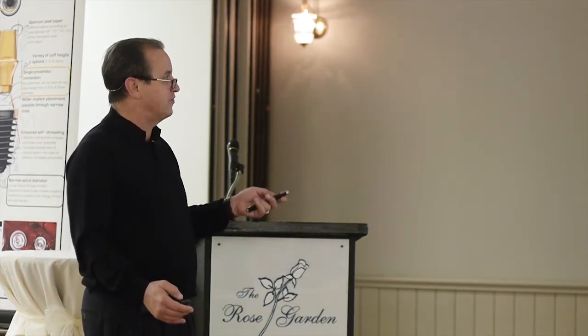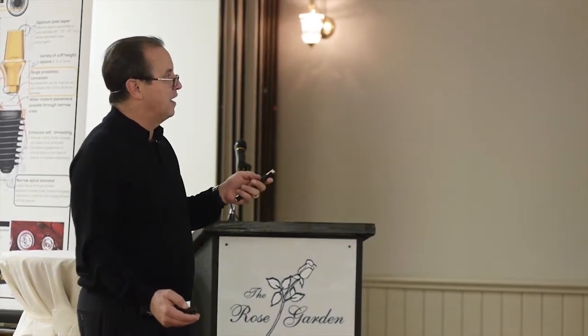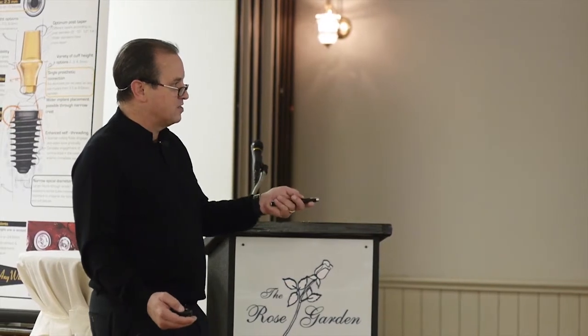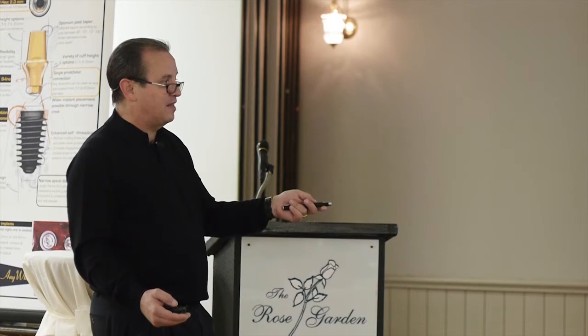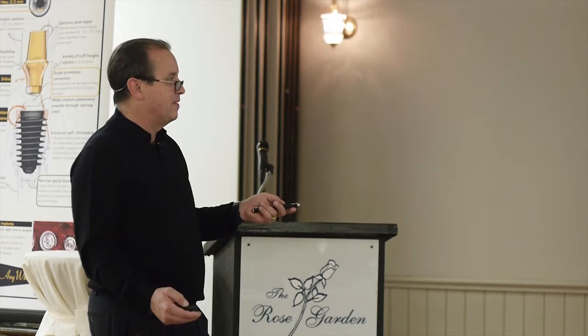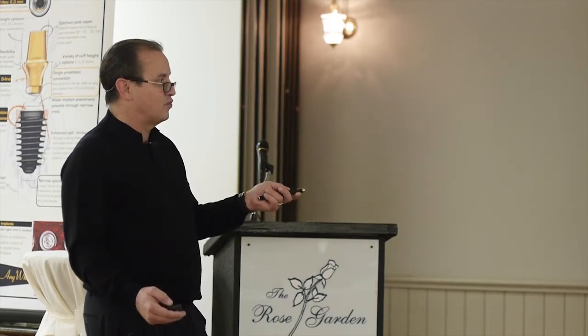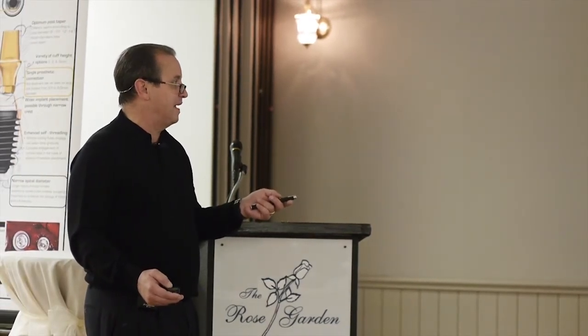You know, we get these great images. I'm going to run through this fast because I know y'all have seen this already. But what I really want you to see is some of the stuff that we're seeing in practice. And this is something that is good to know about, because if you're anticipating doing anything in here, if somebody's got some sinus disease, they need to go see their ENT and get that cleared up. As I said before, it's really important to know where this is, because if you violate this, you can cause a hemorrhage that could block off an airway and cause a patient to get in some real distress. So good to know where that is.